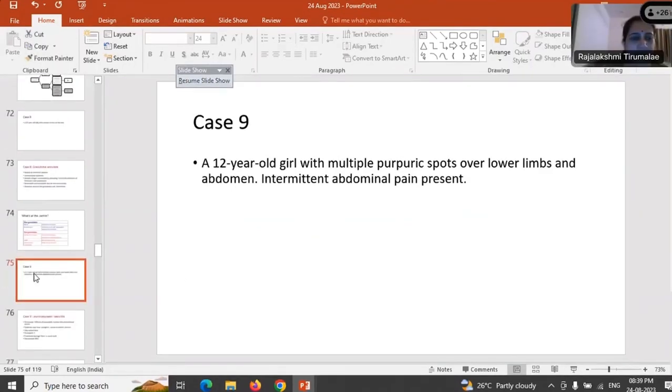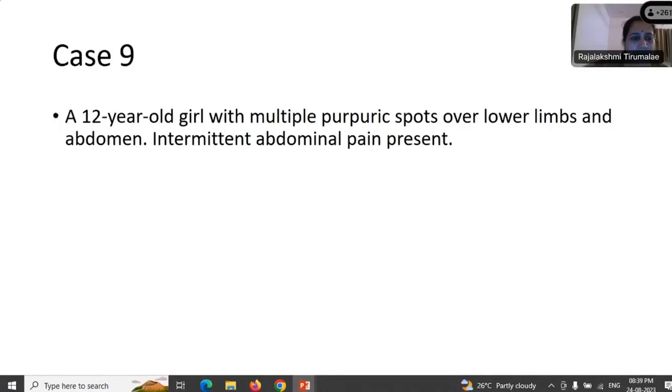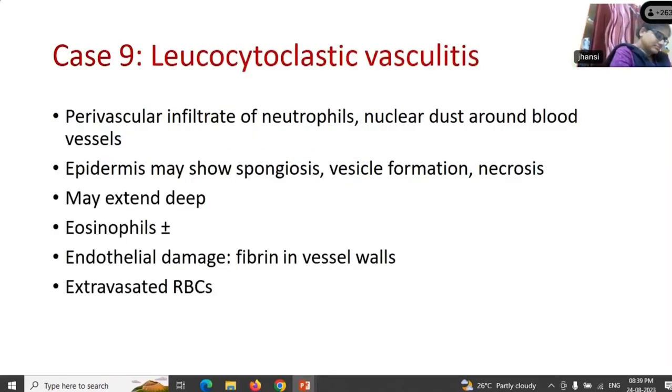Okay. Is there anything in the history for you? Abdominal pain. Something more? Renal function... Henoch-Schonlein purpura, HSP, ma'am. HSP. It could be an IgA-associated vasculitis, what was also called Henoch-Schonlein purpura. How would you confirm your diagnosis? Immunofluorescence. What would it show? IgA. Yes. So you would see IgA-dominant deposits in the vessel walls, right?